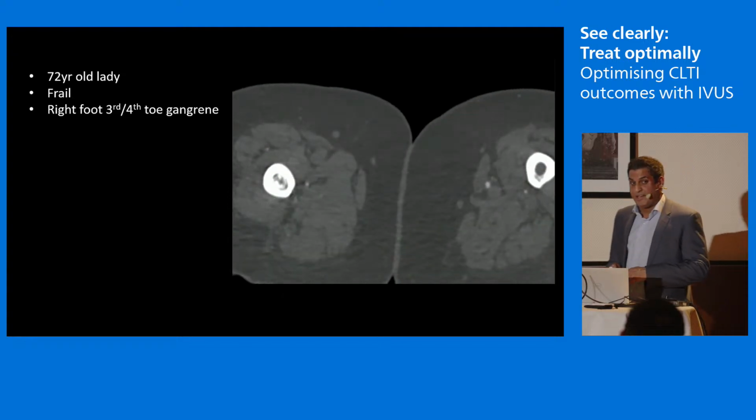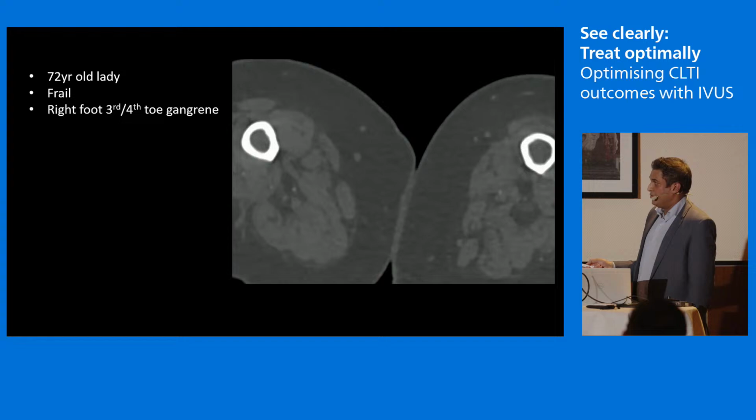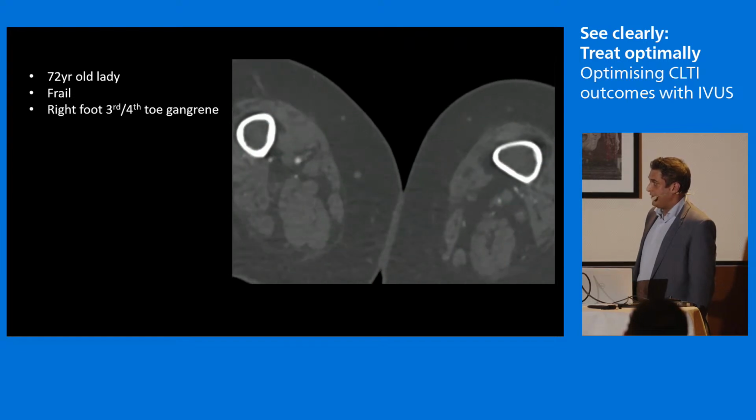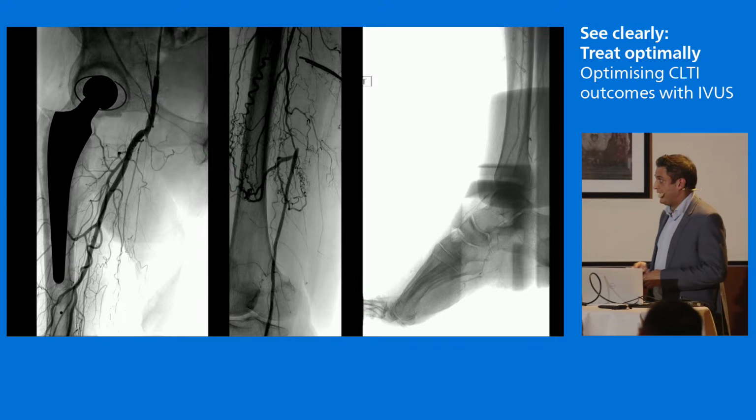So quite a similar case to the last one. But here there's also areas of calcification as well. And you see that it comes back around P1. So here's her angiogram. Okay, so a short stump, and here's where the vessel comes back, and you see that collateral here.